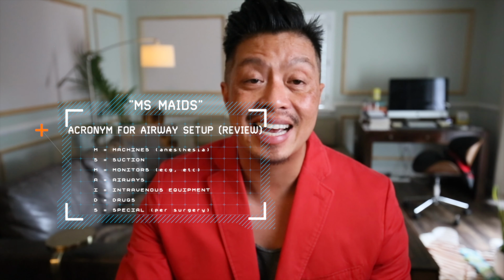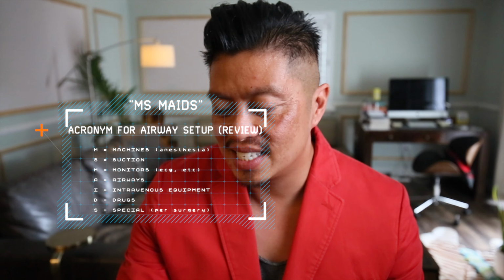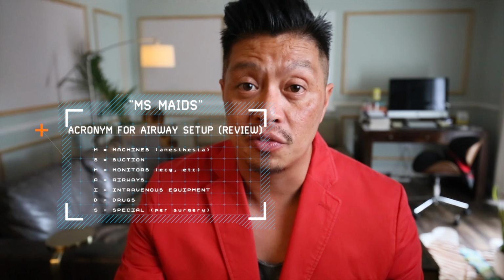That's what comes to mind right now, but I'm sure there's quite a few others, but what do I know? All right, that's MS MAIDS. Another review is that it is a mnemonic for M, machine, S is suction, M is monitor airway, A is airway tray, I is IV, D is drugs and controlled meds, and S is special equipment used for specific conditions.